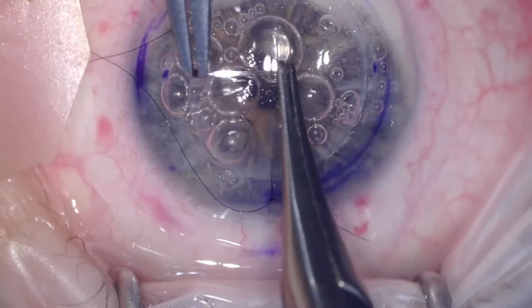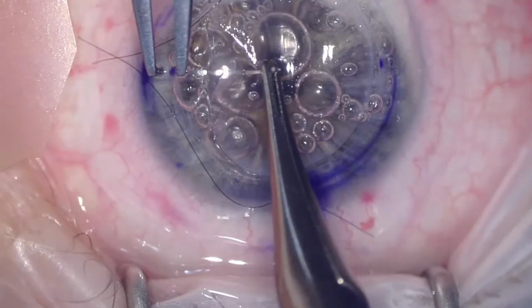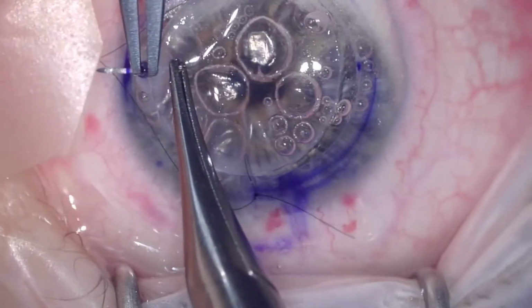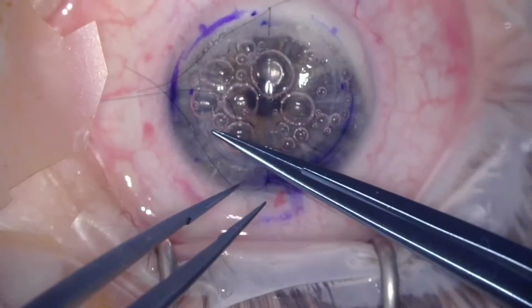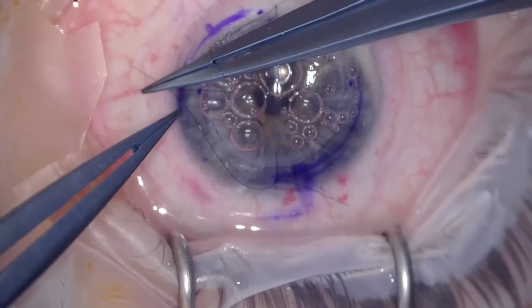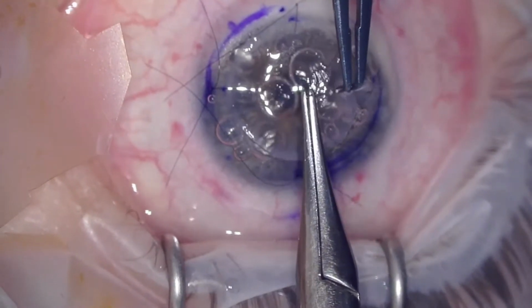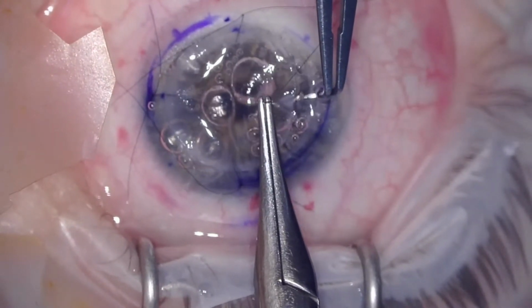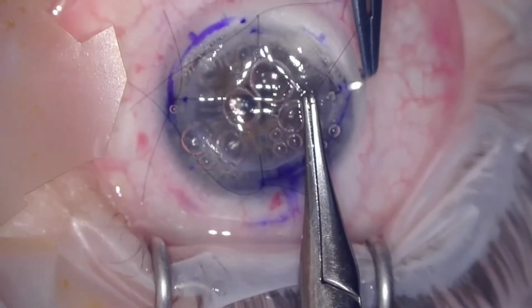So now I'm doing my final 2 cardinals, and again I'm trying to achieve that diamond shape that you should get after putting your cardinal sutures in. So here I'm being very careful not to touch the posterior stroma or the Descemet's, pulling it through. And you see how the air bubbles are maintaining their position within the anterior chamber. If you saw bubbles coming out through the Descemet's, then you know that there is a potential leak or a potential perforation. So here I'm just doing my final cardinal suture and making sure the tension is as adequate as possible.